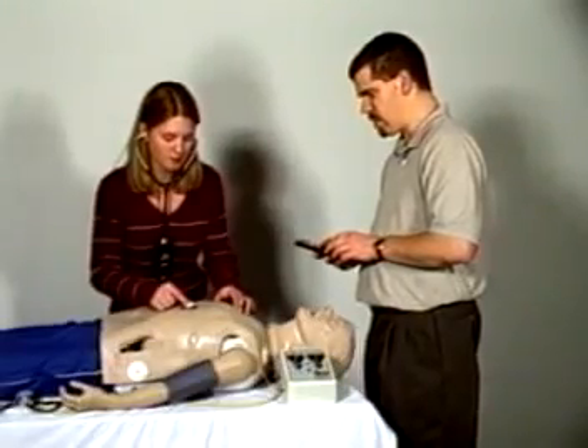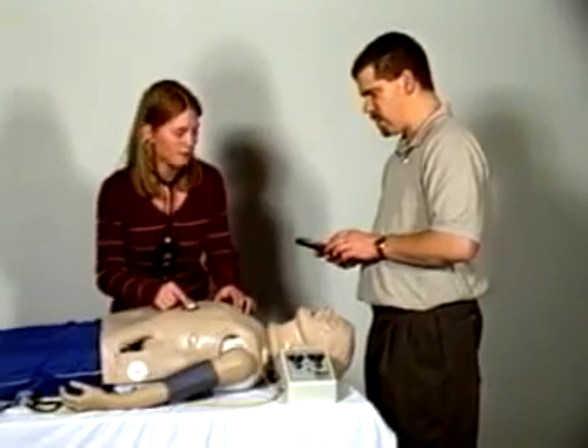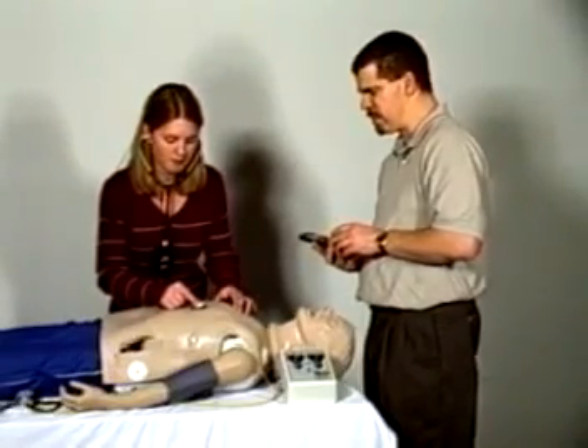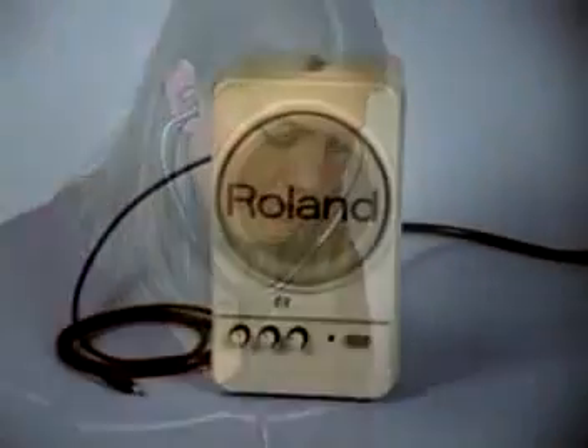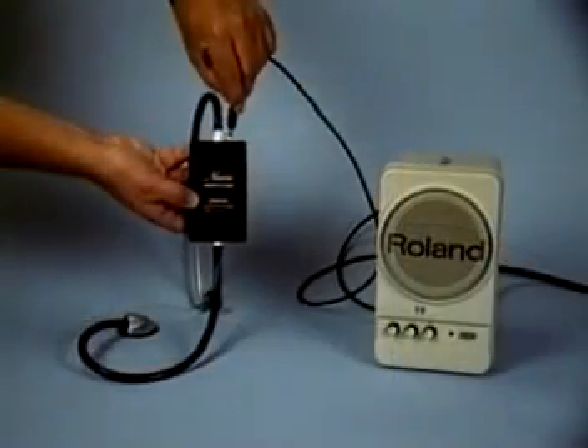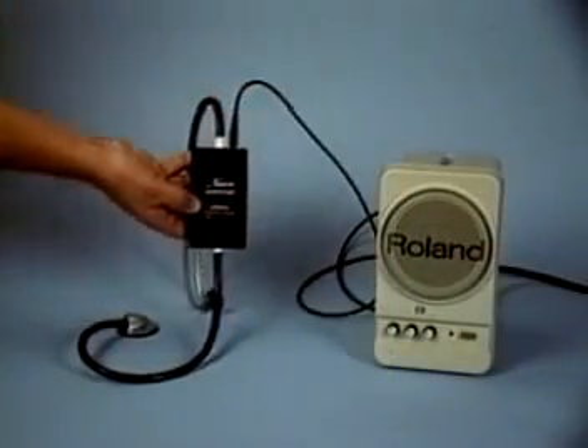A diagnosis can be made by comparing the variations in sounds occurring at different sites, just like a real patient. Instead of an individual using the earpieces on the smart scope, an optional amplified speaker can be used, allowing an entire classroom to hear the heart and lung sounds at the same time. Simply plug the amplified speaker into the speaker jack located on the smart scope.